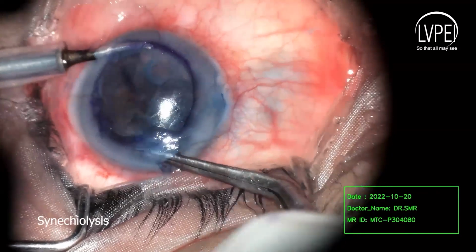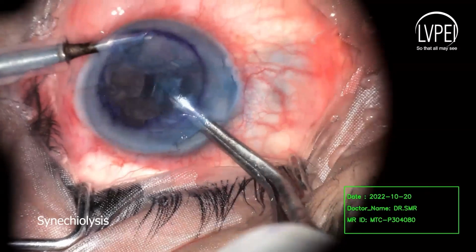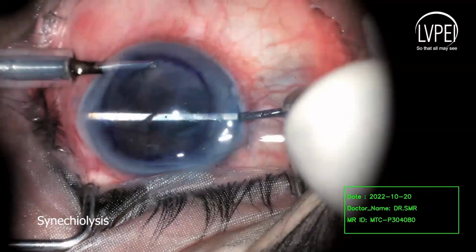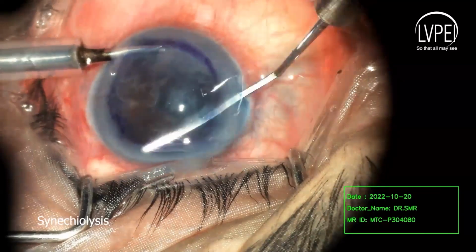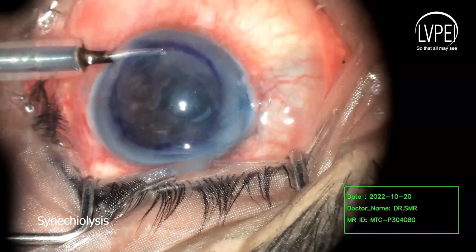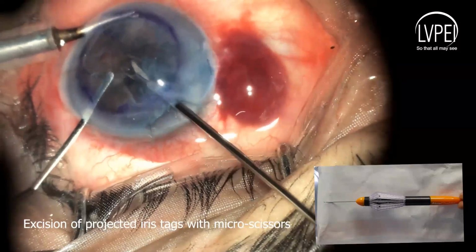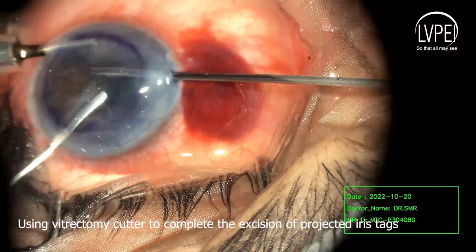The projected iris tags were excised using micro forceps, and micro scissors were used to cut the projected iris tags. This was put for better visualization. This is the release of the synechiae. With the micro scissors, the iris tags were cut flush with the iris. Further, a vitrectomy cutter was used to complete the excision of these projected iris tags.